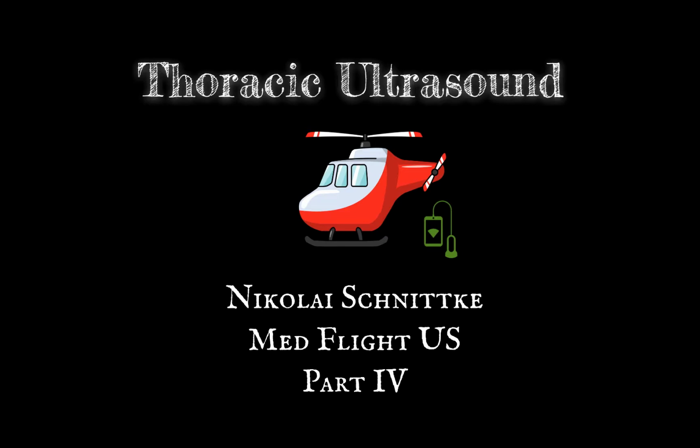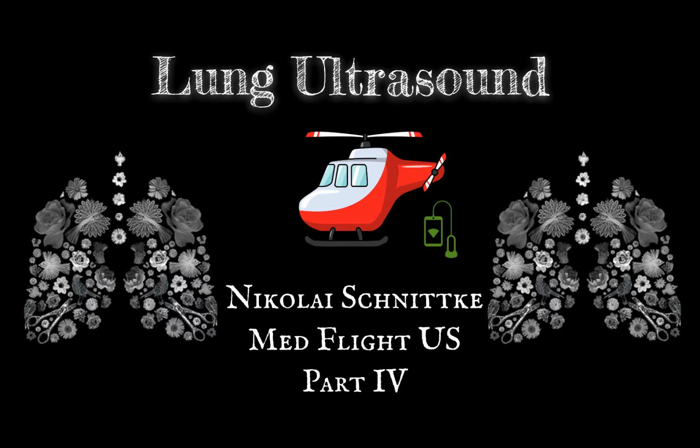Welcome to part 4 of the MedFlight ultrasound curriculum. This talk was originally supposed to be a two-part talk encompassing all of thoracic ultrasound, including the lungs and the heart. However, because this is a pretty broad topic, there's a lot going on in these two fields, and so we split this up into two talks. The first talk that we're going to do today is going to be about lung ultrasound, and the second one, part 5, will be about the heart.